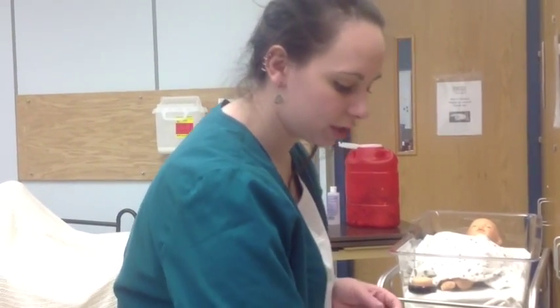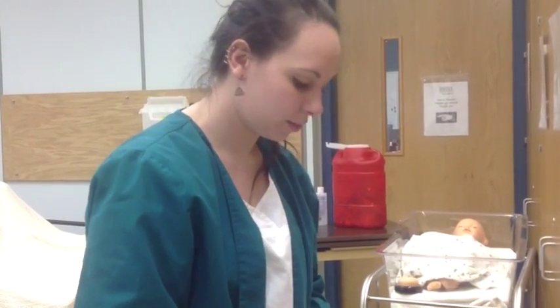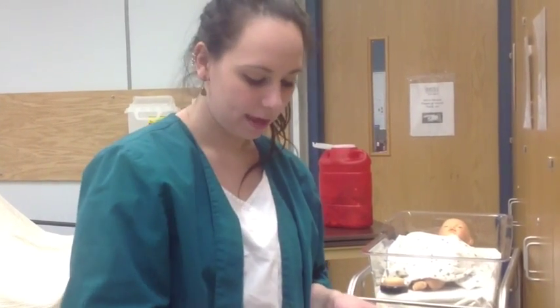If you have multiple injections, some people have, they label the syringes so they know what's the medication within the syringe. This one I'm handling directly, it's not going to go to my site, and I have my MAR, so I feel comfortable having it the way it is, and I'm going to use the tape for the cotton swab if my patient would like to keep that on.